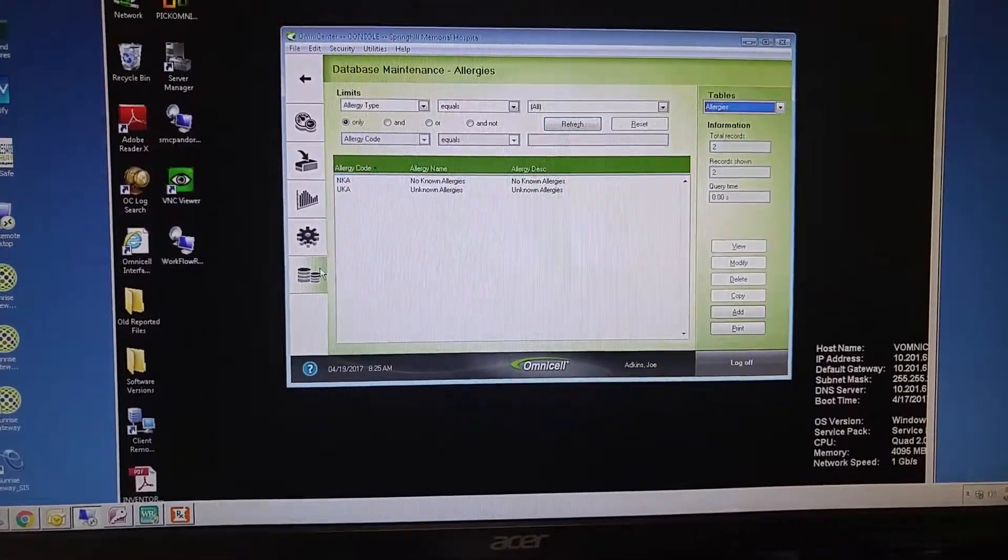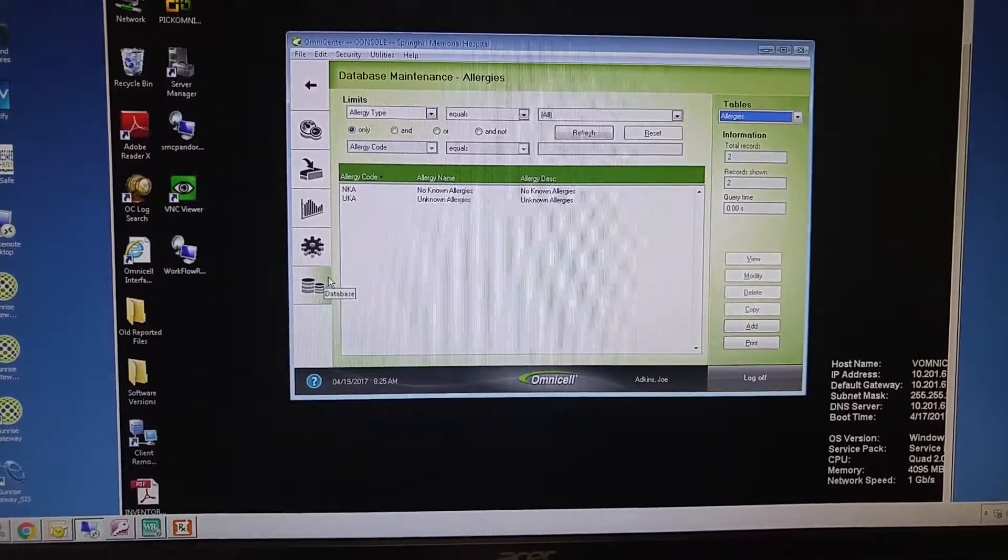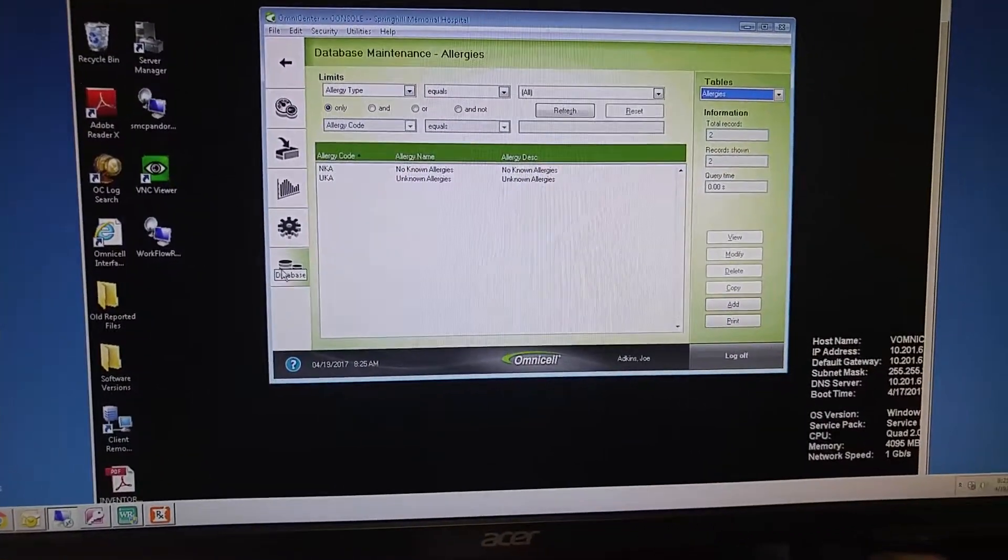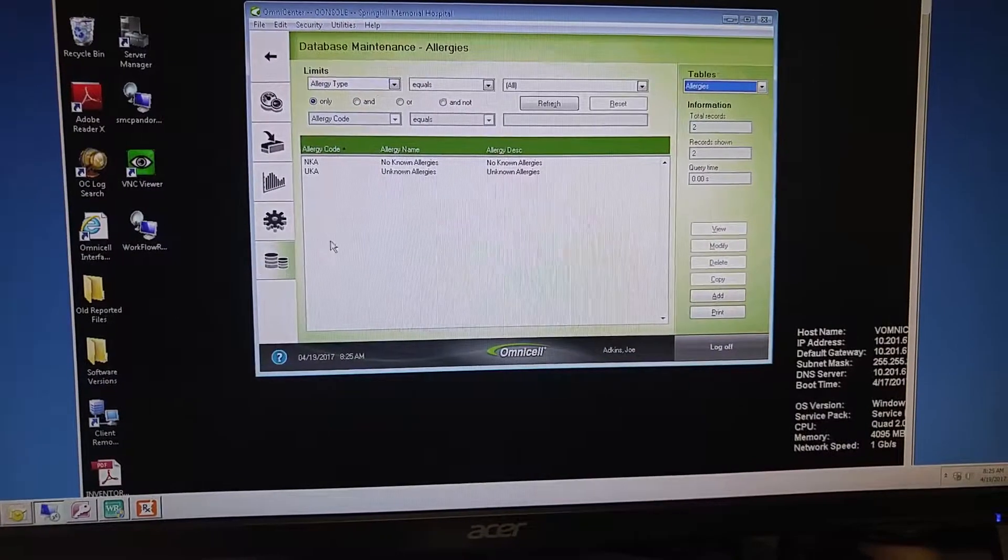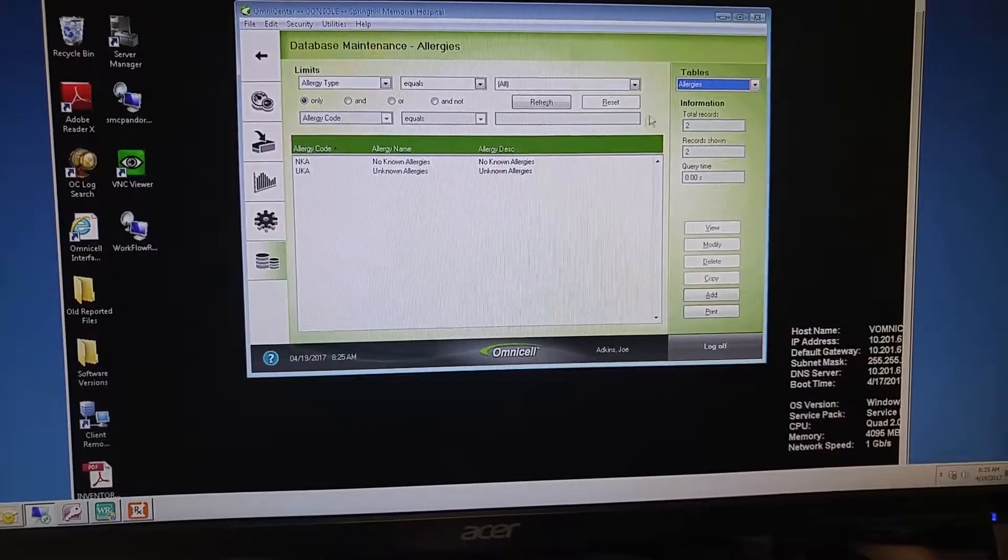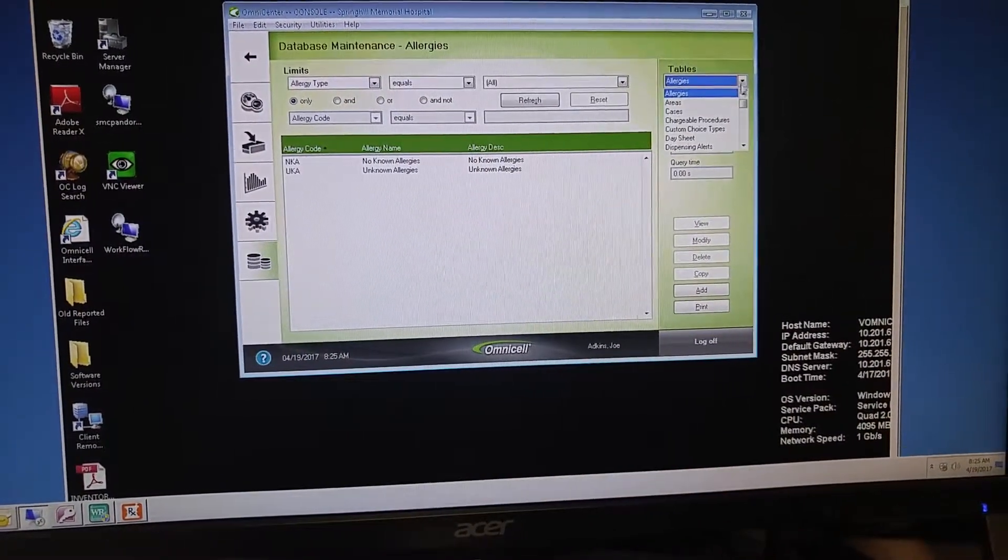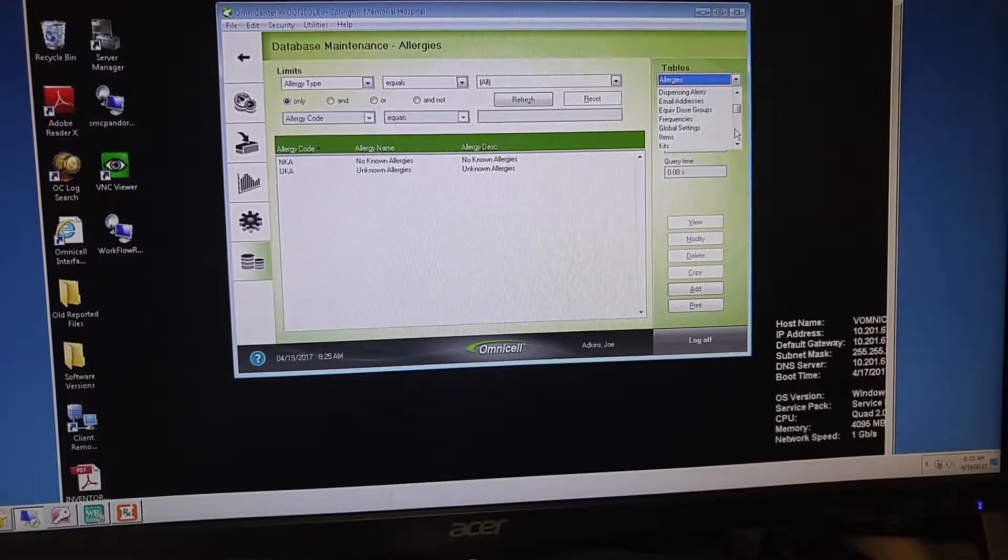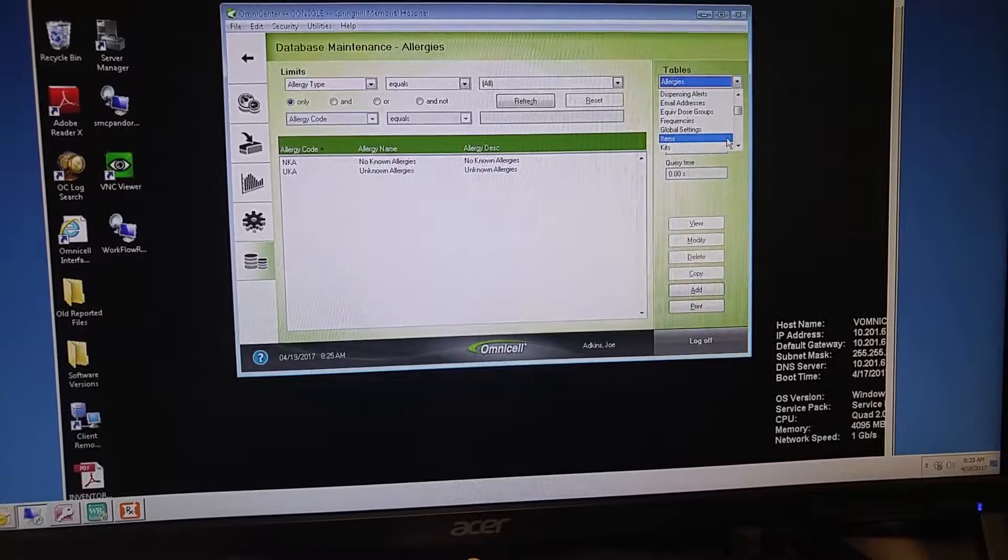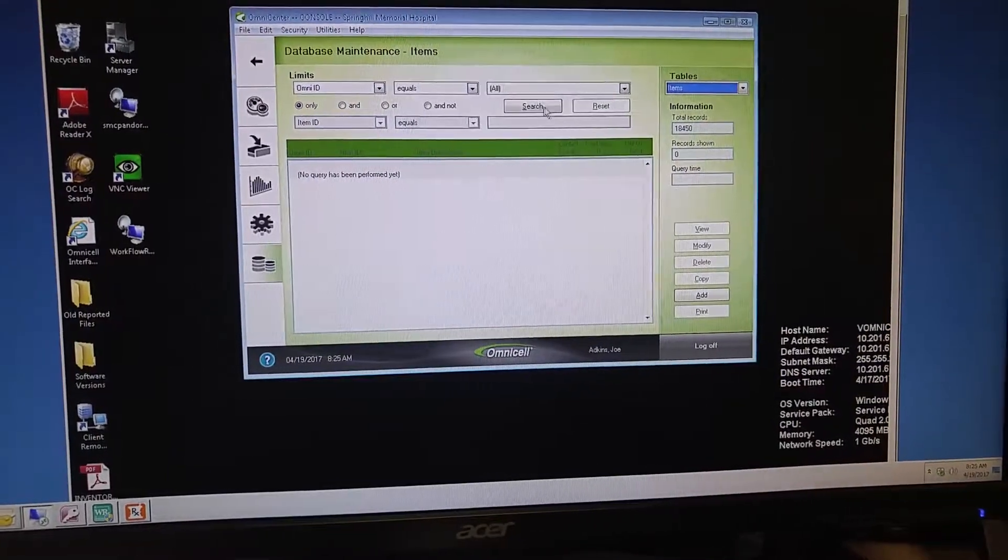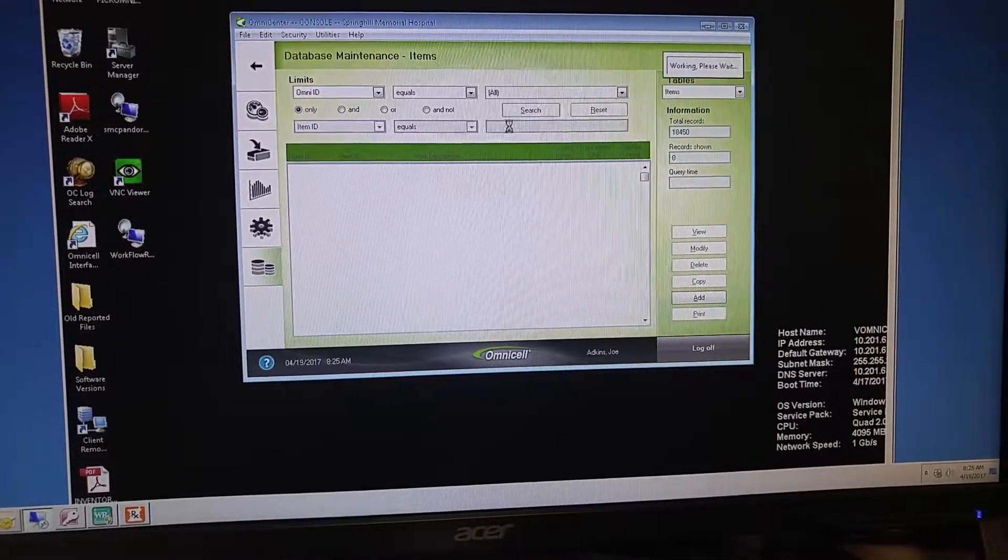So the way to add a new barcode is click on this Database tab, and then in the top right, scroll down to Items, and then hit Search.